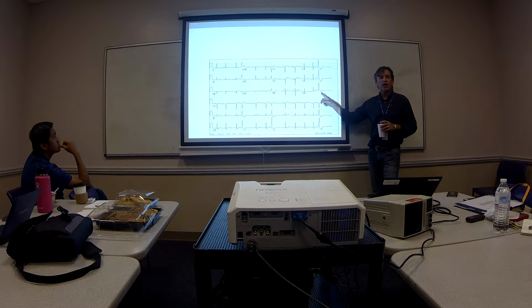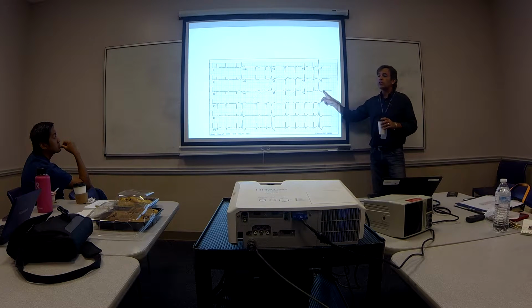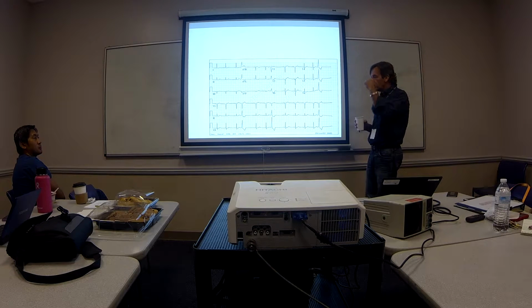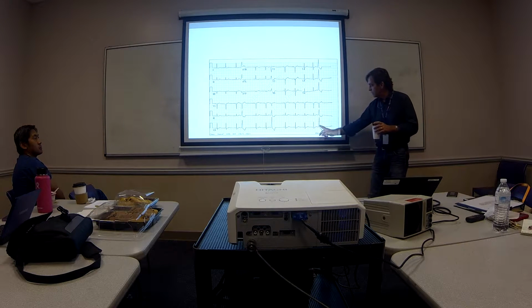If you had to describe it to somebody over the phone, you don't make the diagnosis. You say, hey, I'm looking at an EKG, and every now and then there is an early beat, right? Normal, normal, normal. The next beat should be somewhere here, but there's an early beat.